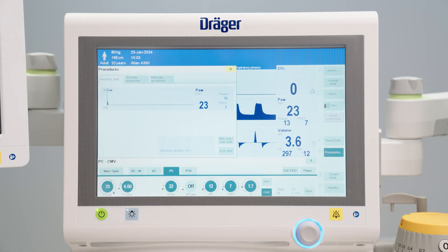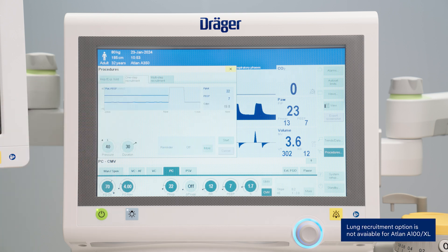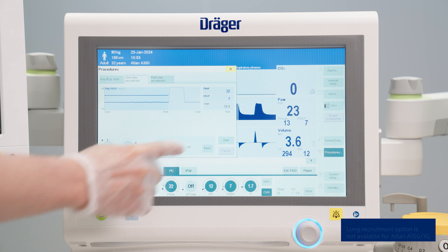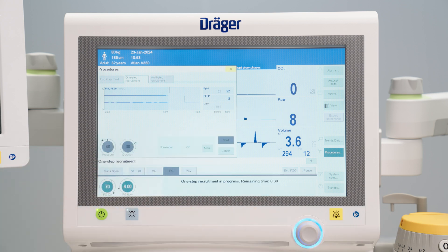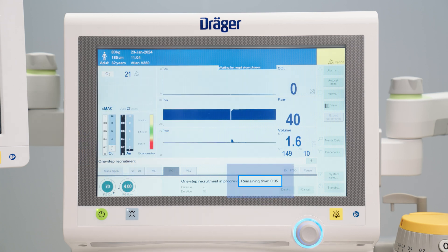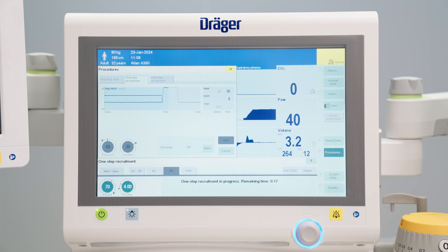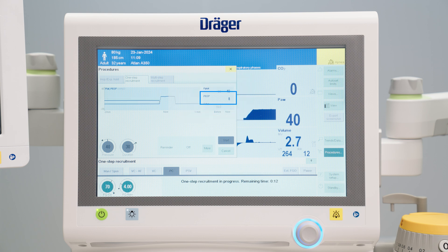All Atlan family devices offer an optional function by which a one-step recruitment manoeuvre can be performed during normal ventilation. After setting the desired pressure level and inflation time, the manoeuvre can be started by pressing one button. Once the manoeuvre is over, the device automatically switches back to the previous ventilation setting. If possible, this manoeuvre should always be followed by an adequate PEEP to avoid a pressure drop in the respiratory tract below the alveolar closing pressure, and to prevent recurrent atelectasis formation.